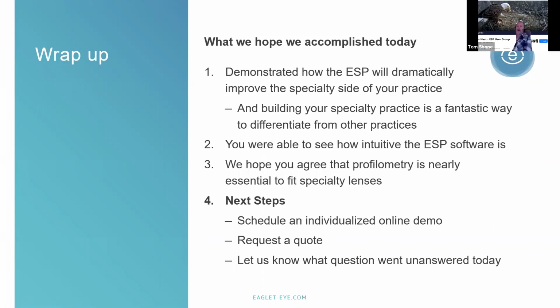I think you can see my screen. Before I go any further, Tom, I want to thank you for those kind words. I hope you're right. We work very hard to make the customer, the user, the number one priority. And Reinier, I'll thank you as well for that great overview of the software and some of the deep dives. And I will remind you that when I'm done talking, we'll turn it over to live Q&A. And while I'm trying to wrap this up in an hour, we are happy to stay until the last person leaves. So if you've got questions, don't hang up.